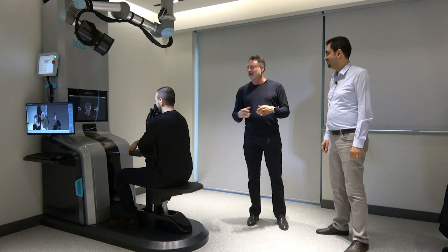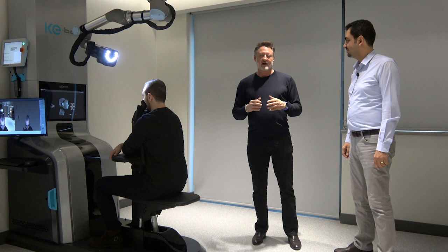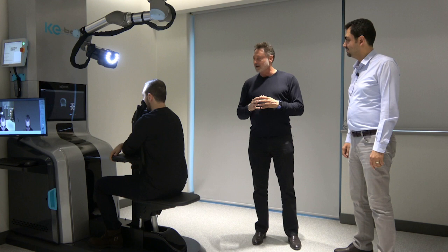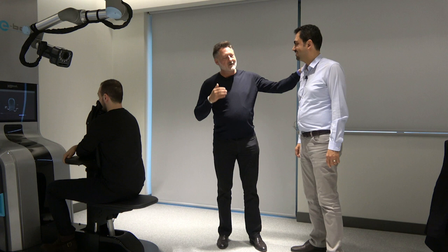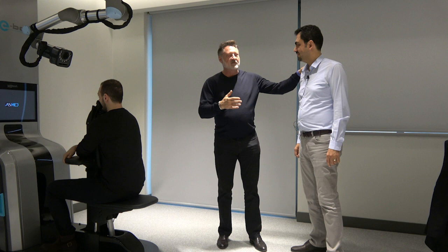This is probably one of the more exciting aspects of what Dr. Erdogan has done here at ASMED. We're here with the KBOT, which is an artificial intelligence imaging system designed by Dr. Erdogan and Osan, who is an electrical engineer specializing in imagery and artificial intelligence. He's put all this together.